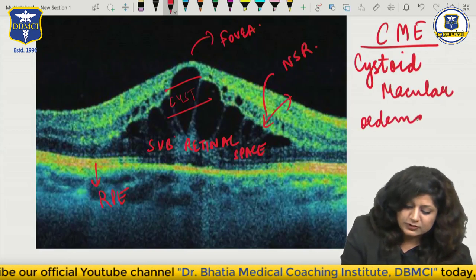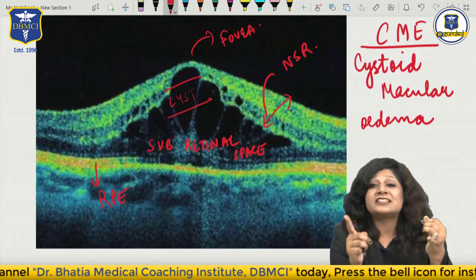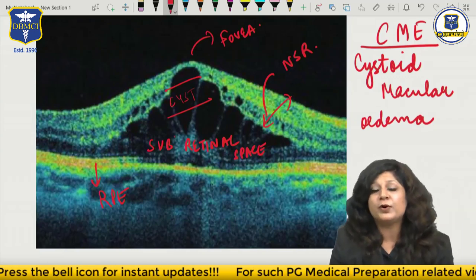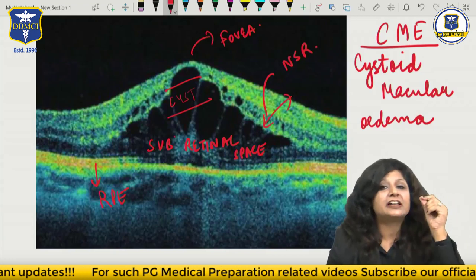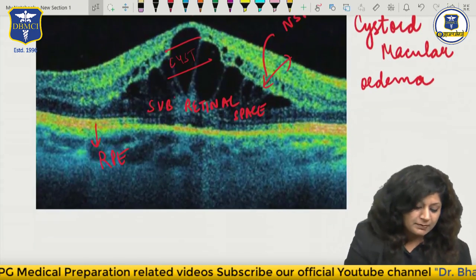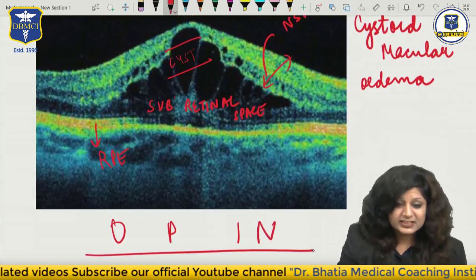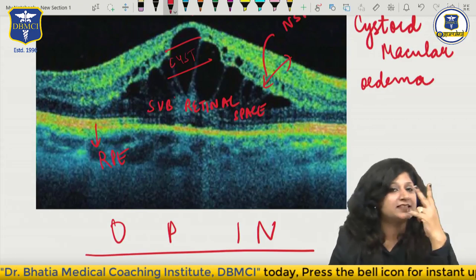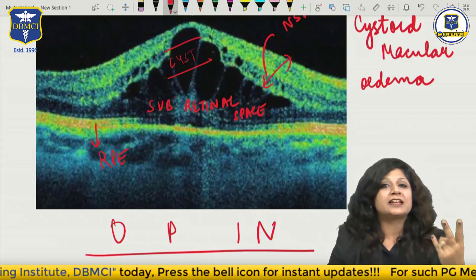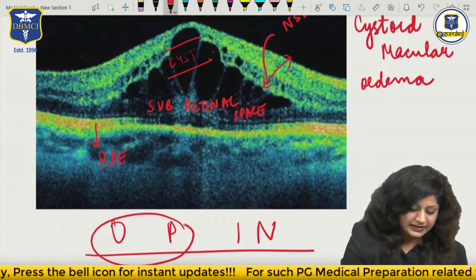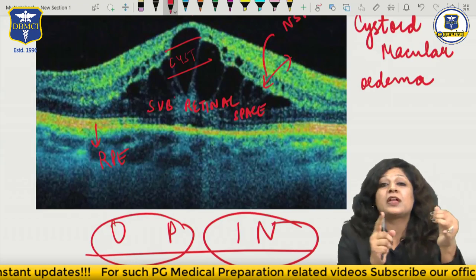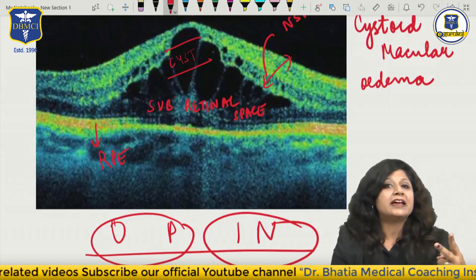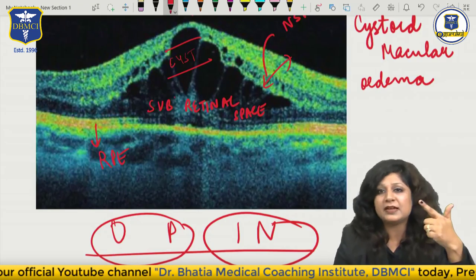Therefore it is a case of cystoid macular edema - cyst-like spaces in the macular area due to collection of fluid. Edema means collection of fluid. Which layers are involved for the collection of fluid? Always remember it is OPEN - two important layers which open the gate for retinal diseases: the outer plexiform and inner nuclear layer. You can remember it by OPEN - outer plexiform, inner nuclear layer - two important layers in which you can get edema.